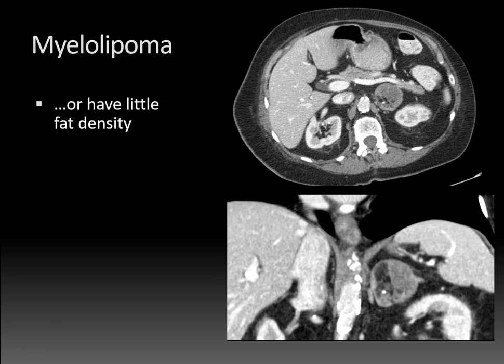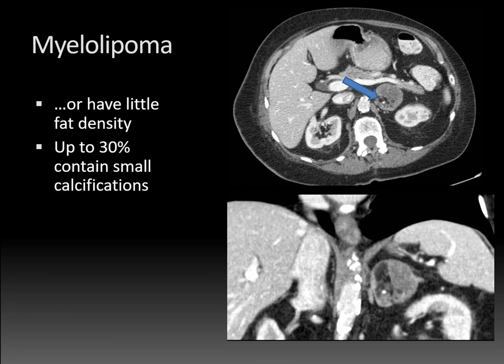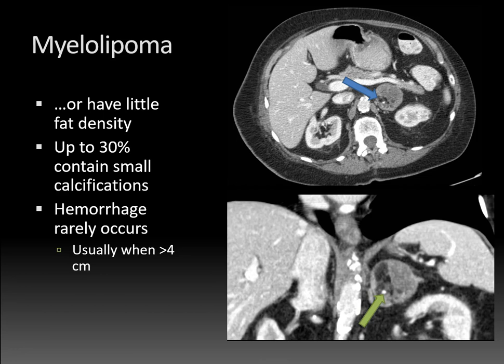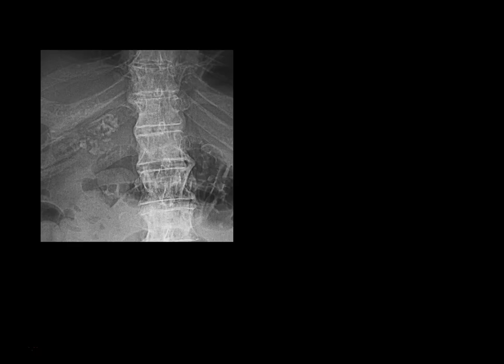Myelolipomas can also have very little fat density — here's an example of just a small amount of fat density within an otherwise soft tissue-predominant myelolipoma, with the blue arrow pointing to the small area of macroscopic fat. It's also not unusual to have small calcifications within myelolipomas — up to 30% can have calcifications, denoted here by the green arrow. Other adrenal masses that can have calcifications include pheochromocytomas and adrenal cortical carcinomas. Hemorrhage is a potential complication of myelolipoma, but it's very uncommon and typically only seen when tumors become large — more than four centimeters. The nice thing about myelolipomas is they're completely benign with no risk of malignant transformation.